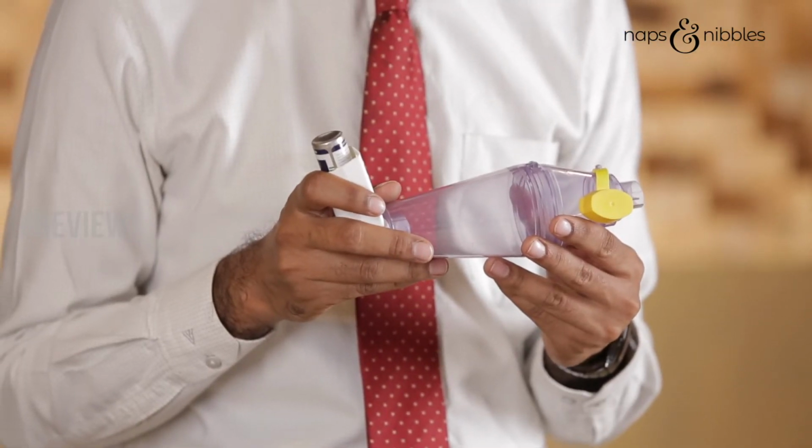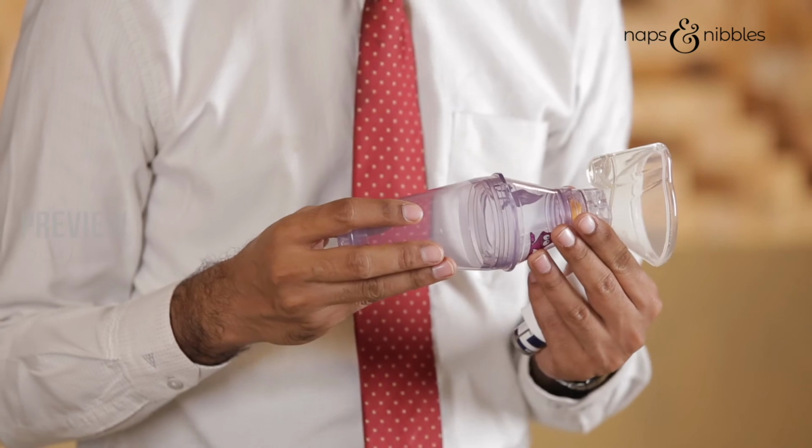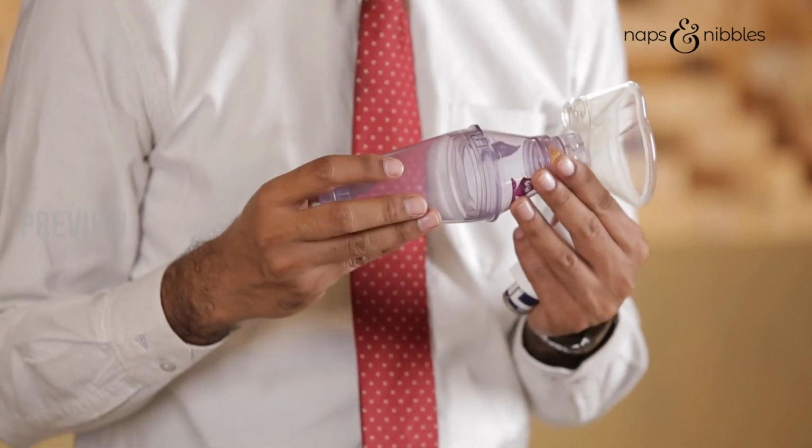If your child is very comfortable taking the inhaler with a spacer, you can also try to tell your child to take a deep breath and hold his or her breath for a few seconds after taking the breath through the spacer. For younger children, less than 4 years, we prefer to use the mask attached to the spacer, as the child will not be able to hold the spacer with a good seal in the mouth.